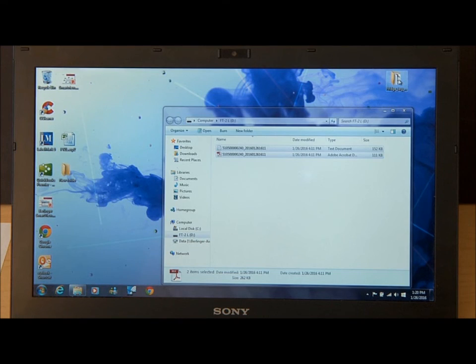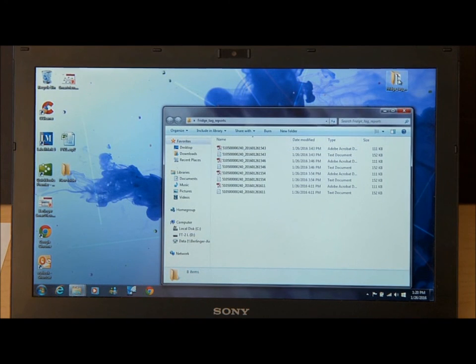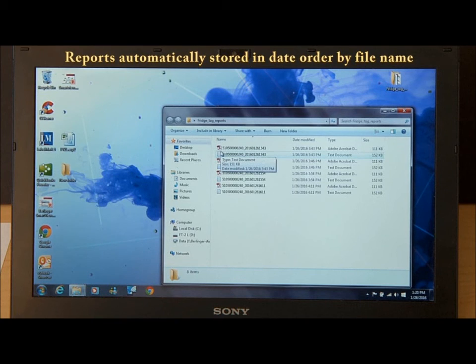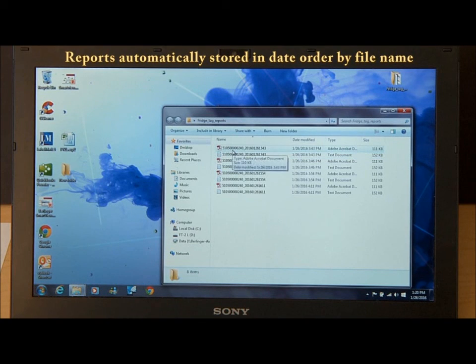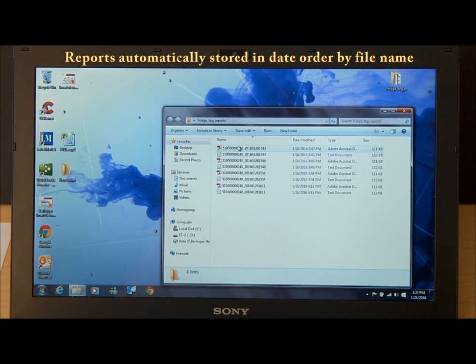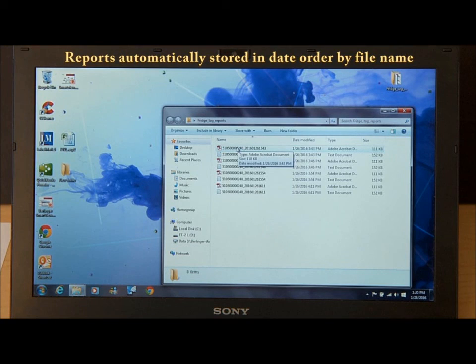If we open that folder, you'll see multiple reports stored by the automated file name which includes the serial number of the Fridgetag 2 and the date and time that the report was generated, so that the top report in your file is always the most recent report.